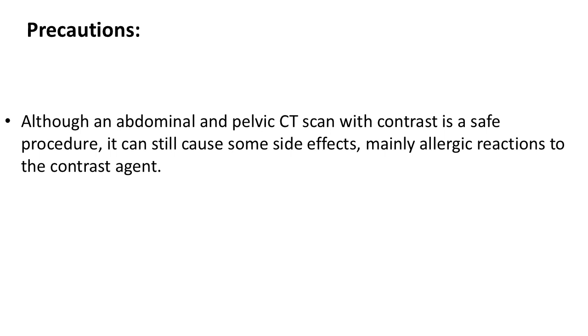Precautions: although an abdominal and pelvic CT scan with contrast is a safe procedure, it can still cause some side effects, mainly allergic reactions to the contrast agent.